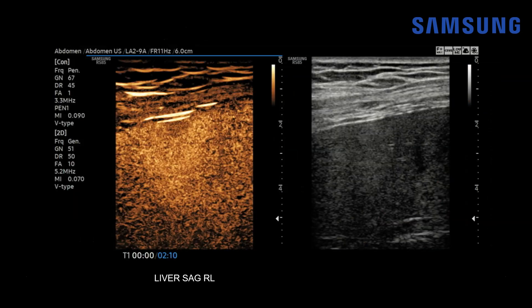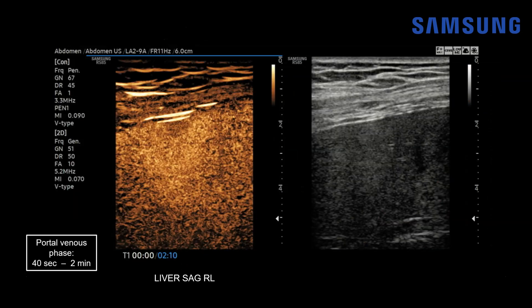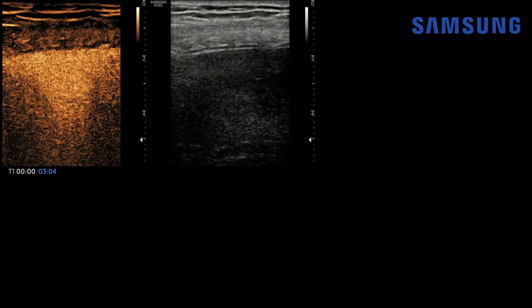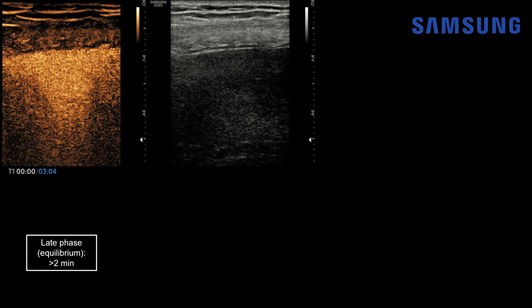As we continue to monitor this lesion, now we're at two minutes. After the arterial phase ends at 40 seconds, we're in the portal venous phase until about two minutes, and you can see that the lesion is fairly diffusely enhancing. Continuing to three minutes post-contrast, we're entering the late equilibrium phase, which begins about two minutes after contrast injection. The lesion remains diffusely enhancing.